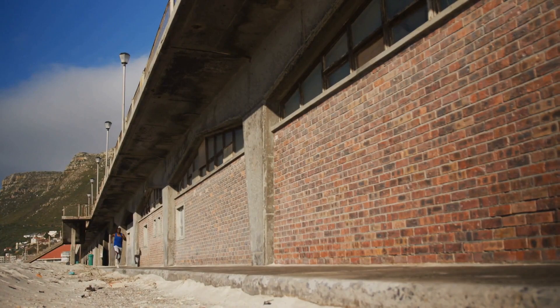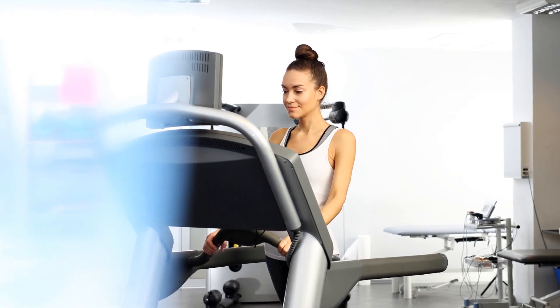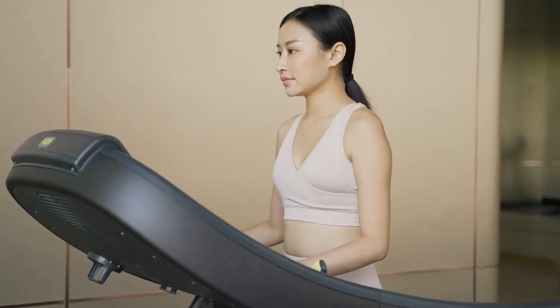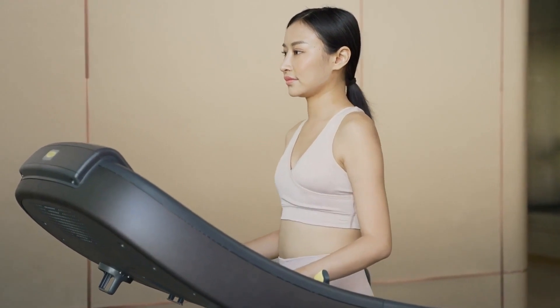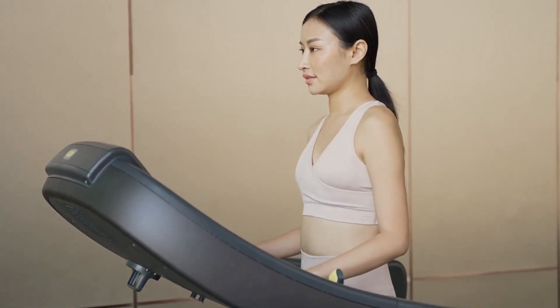The dual-AC motor drive ensures endurance and performance even during extended use, and starts at a true zero for those requiring a gentle beginning. The console, while not the most advanced, offers a clear LED display and a dozen programs to keep your workouts varied and challenging.